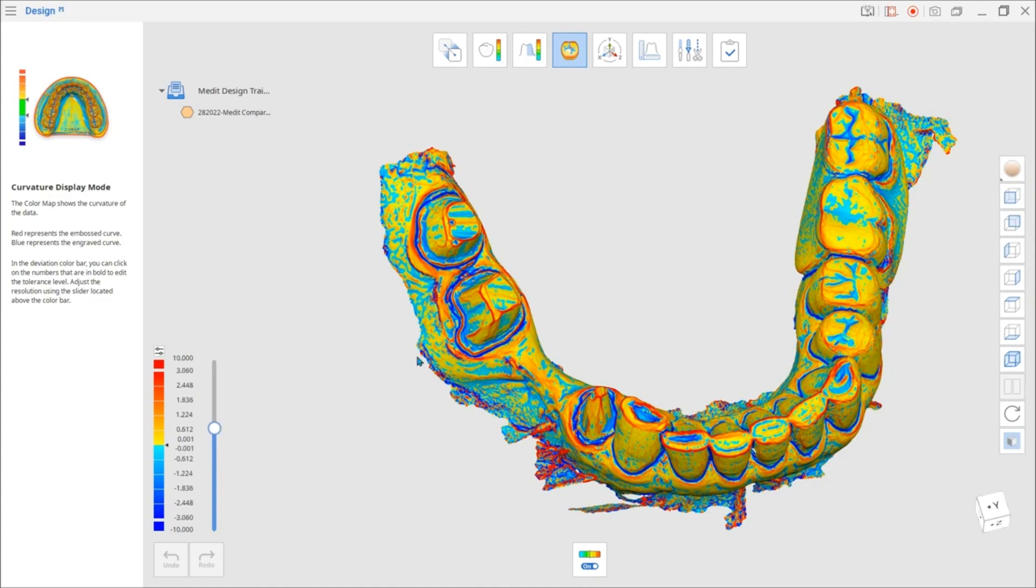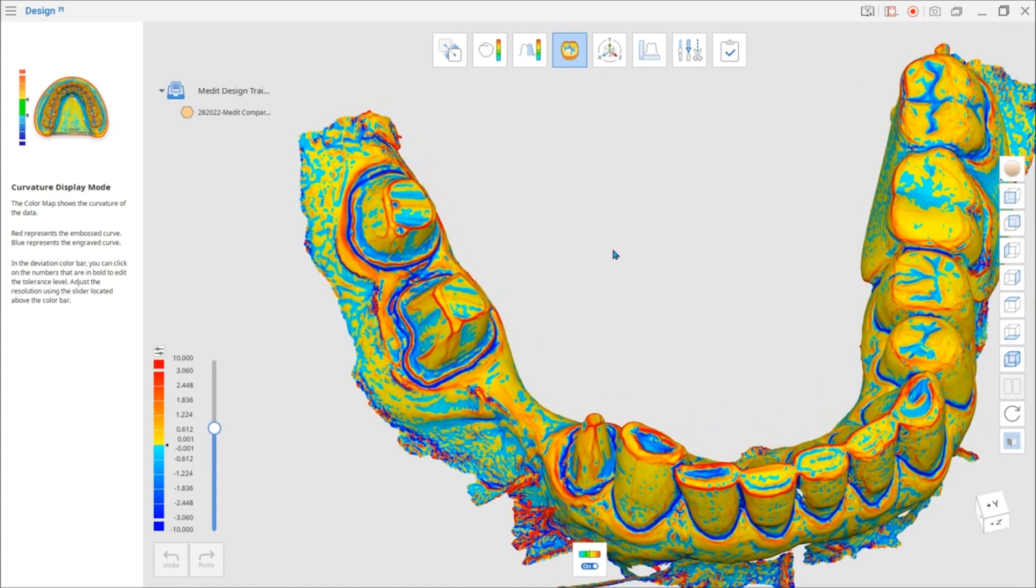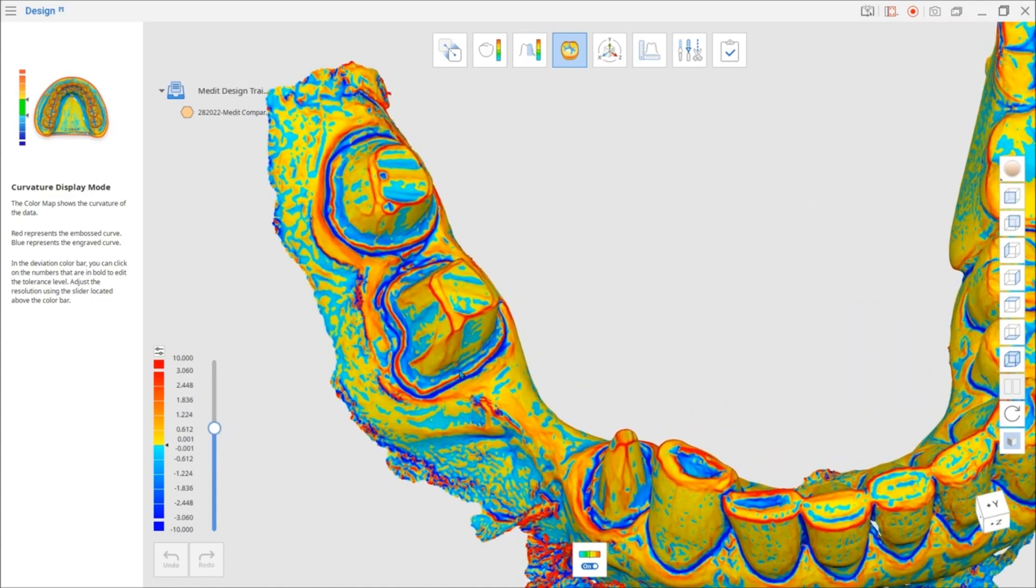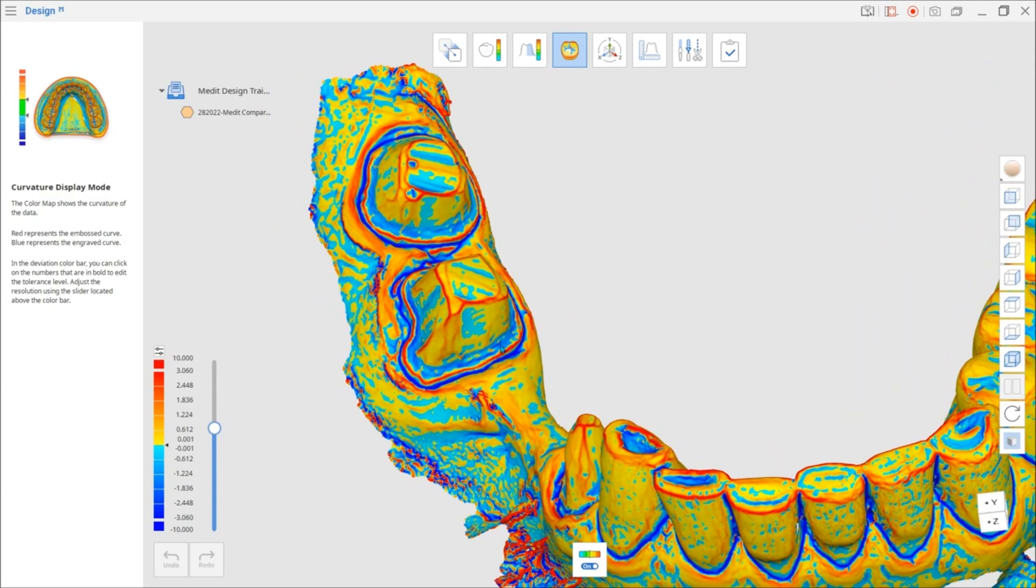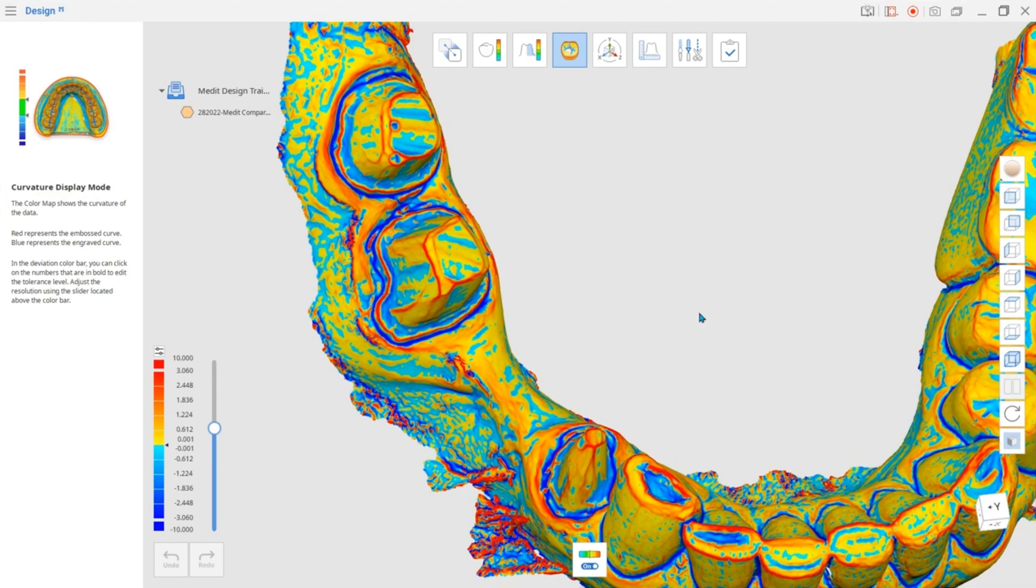The color red shows areas that are embossed and blue areas that are engraved. In other words, the red areas will raise in relief from a surface and blue areas will have a shallow depth. Here you should check the depth of the margin line or look for any areas that are engraved too deep.